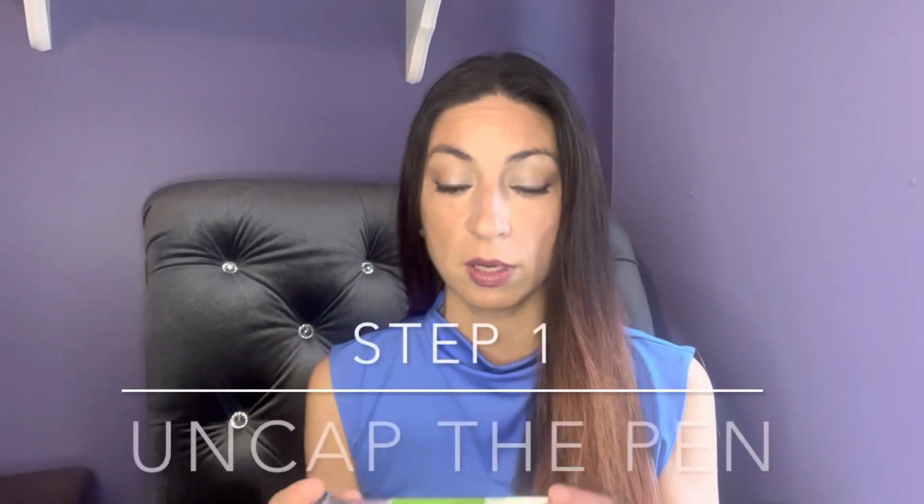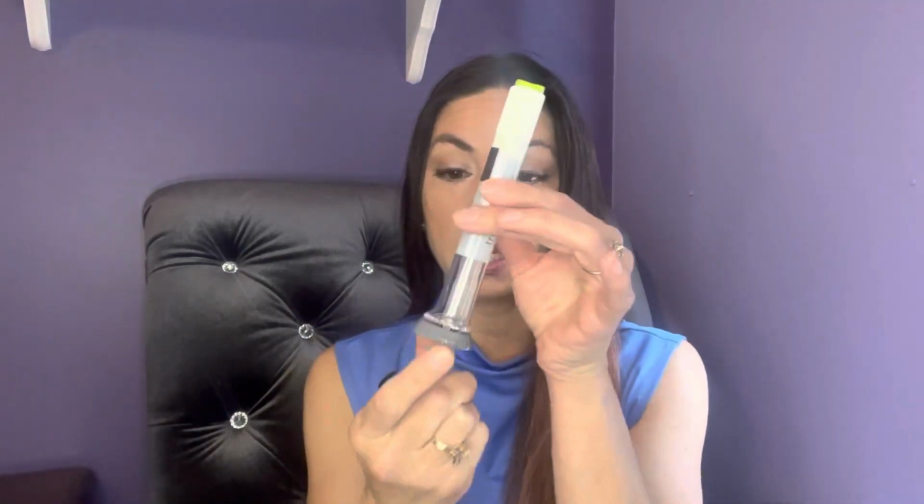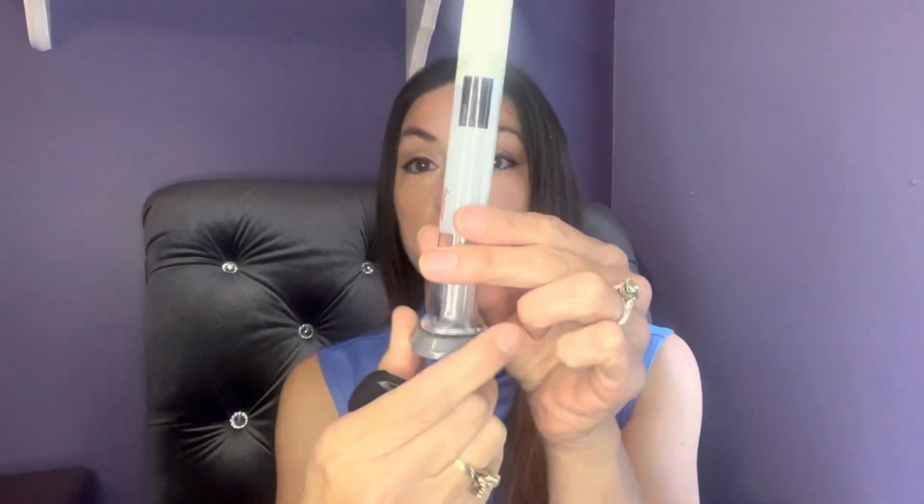There are 3 steps on how to inject it. The first one is that you are going to take off this gray cap that's on the end. So this is what the pen looks like. And to remove the gray cap, you just pull straight down. So pull that straight down and it comes off, and then you can discard it.